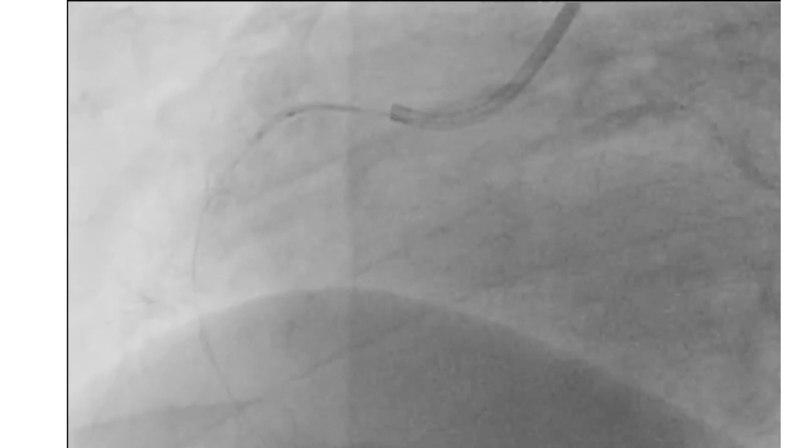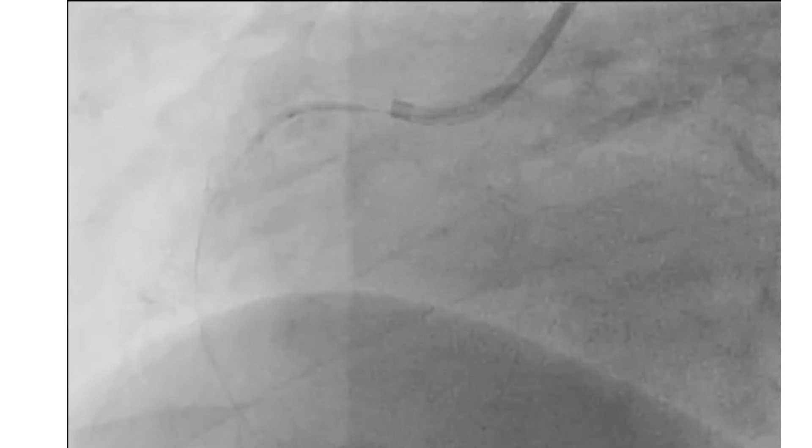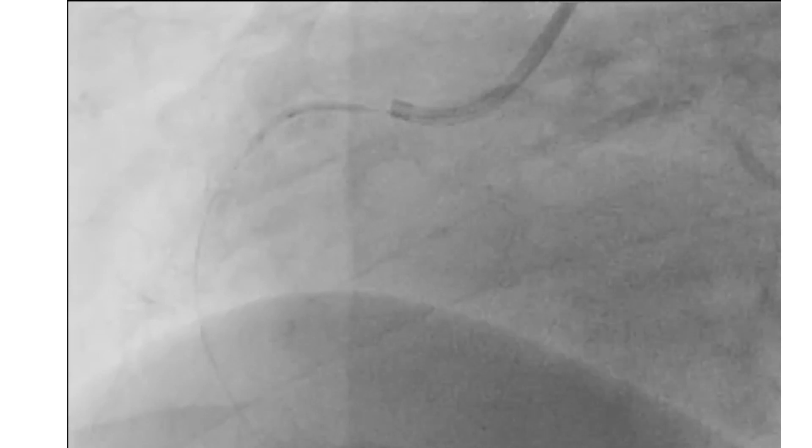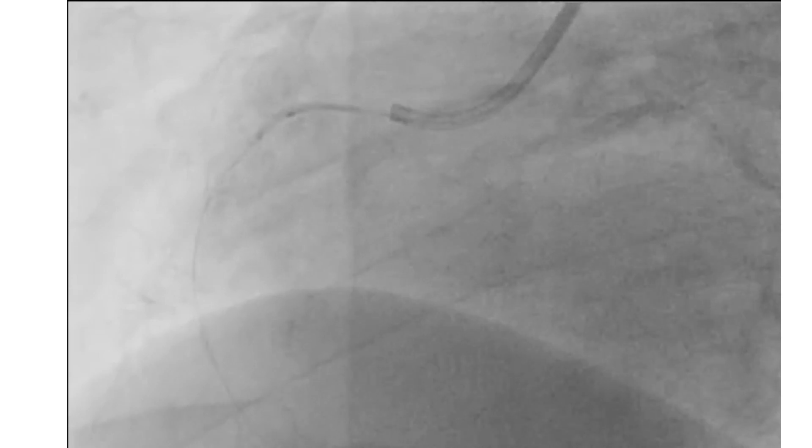We tried to modify the proximal part by inflating the balloon to very high pressure, but that was not useful. In such cases, you have to be sure that your wire is intraluminal. Since our plan was to use rotational atherectomy for the left system, we decided to use it also for the RCA, because modification of the lesion by atherectomy will make further balloon and stenting procedures easier.